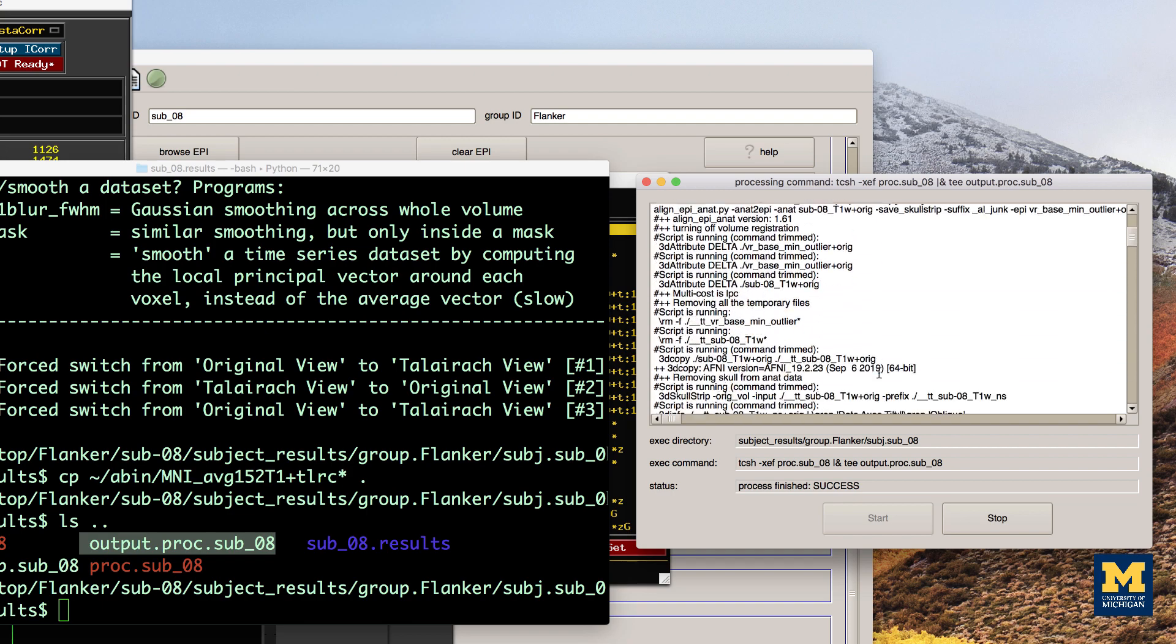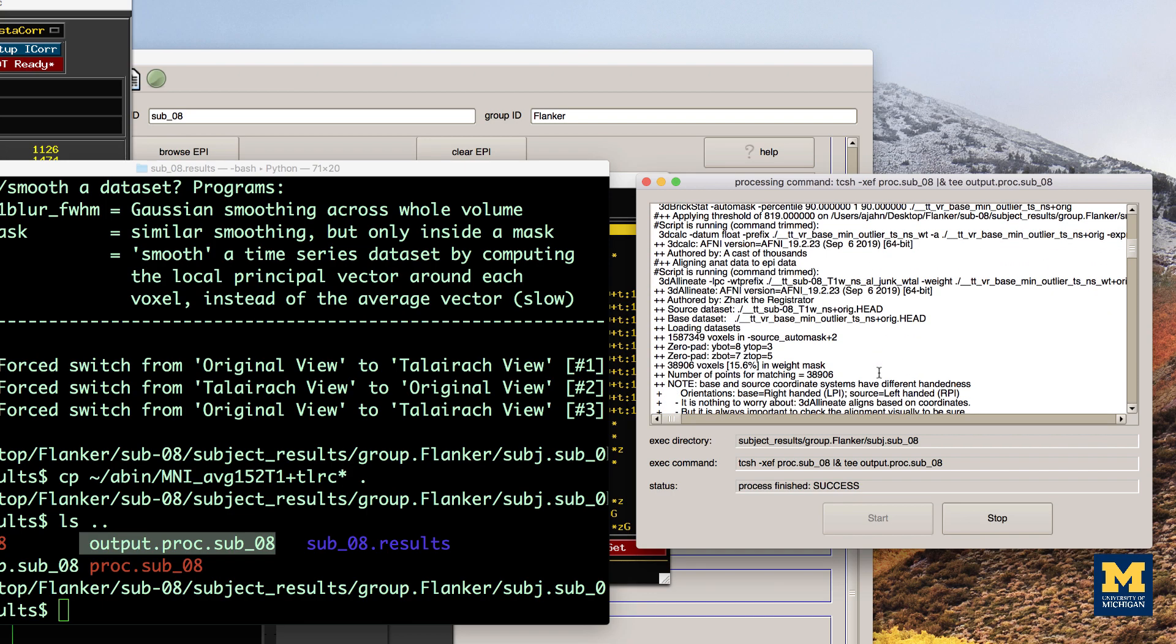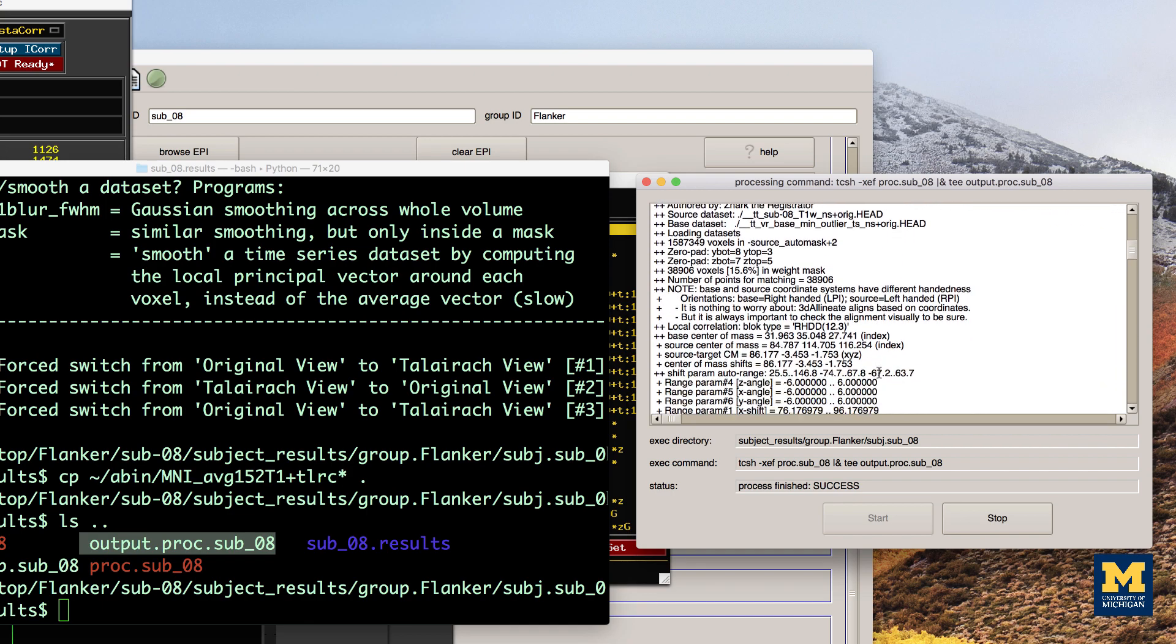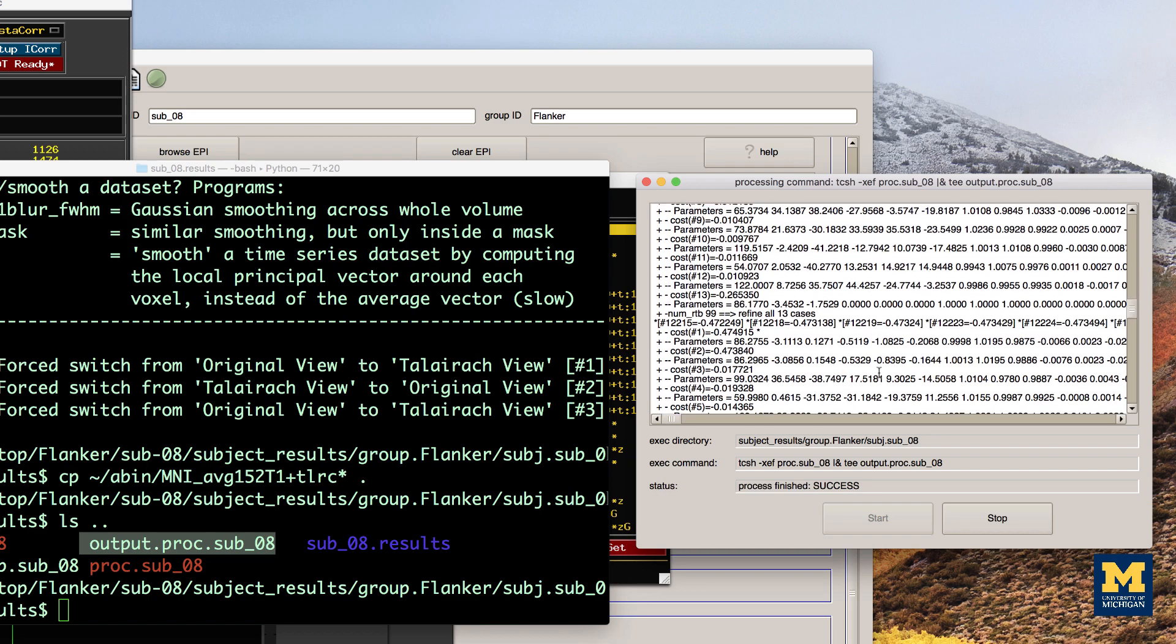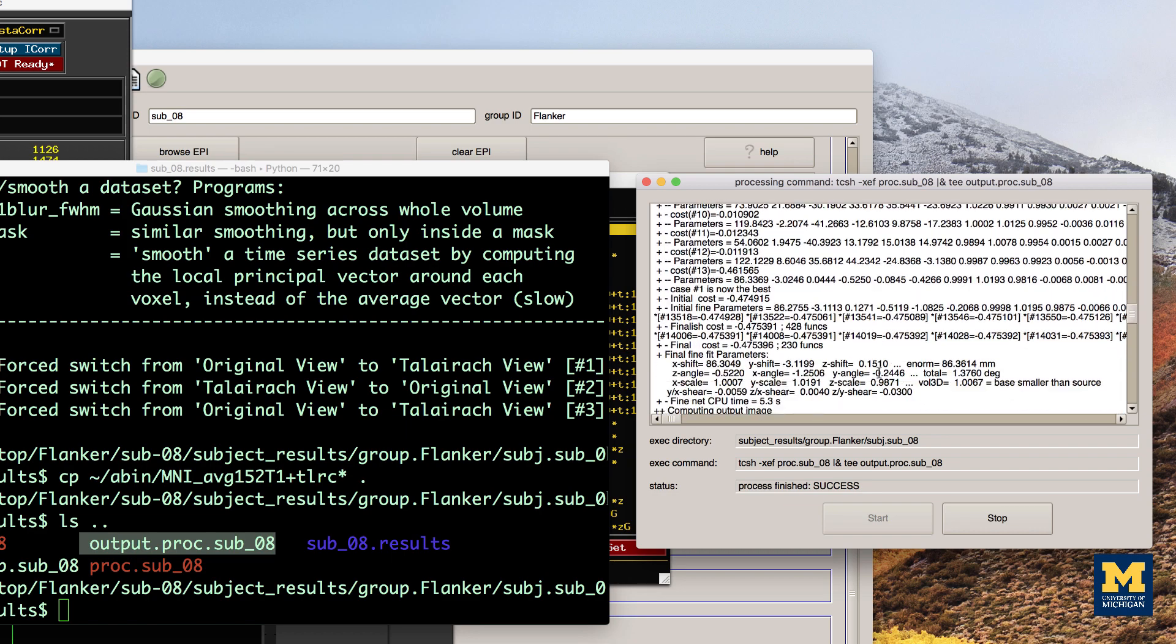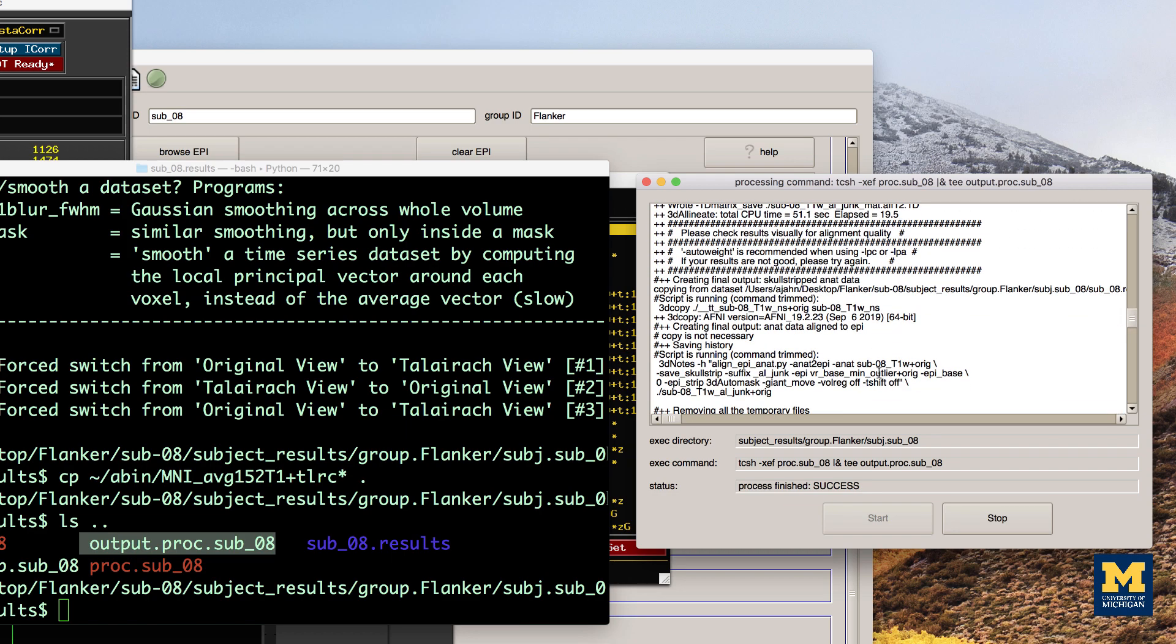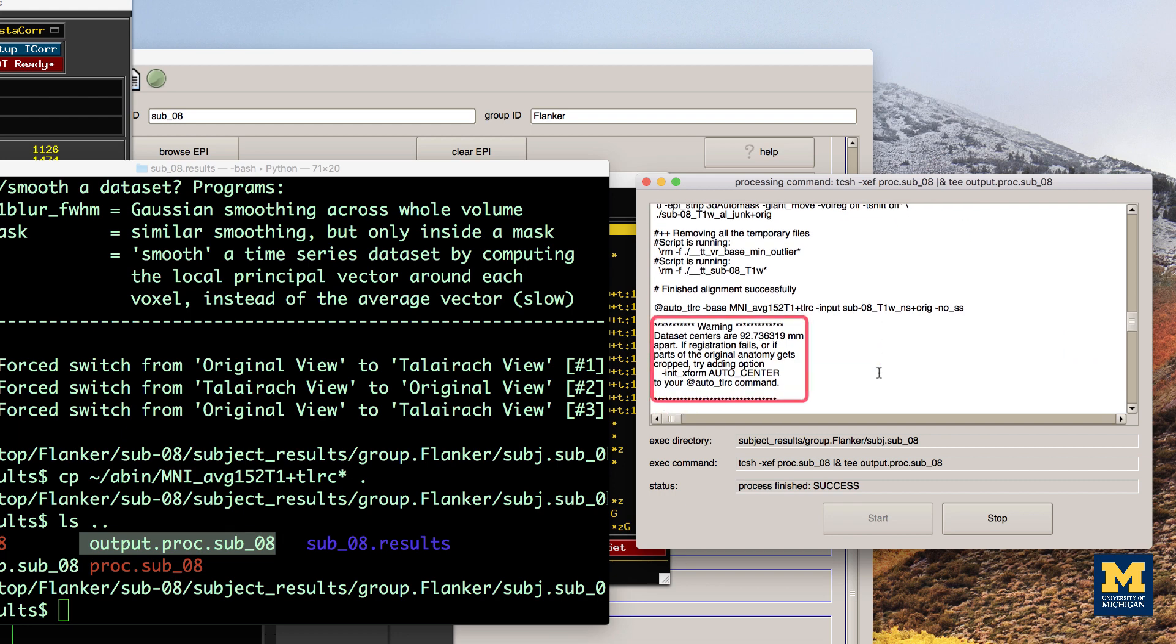Another warning related to our current problem occurred during the normalization step. This can be found slightly after the halfway point of the output, after the @auto_tlrc command.